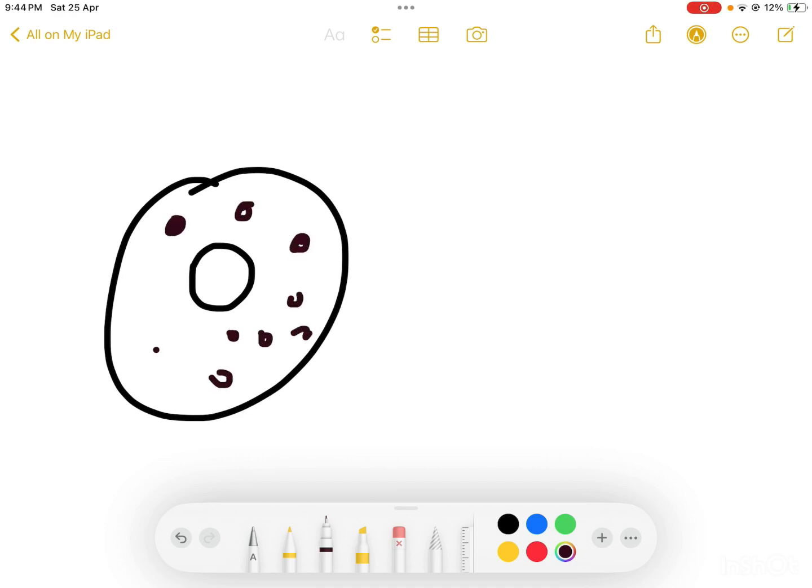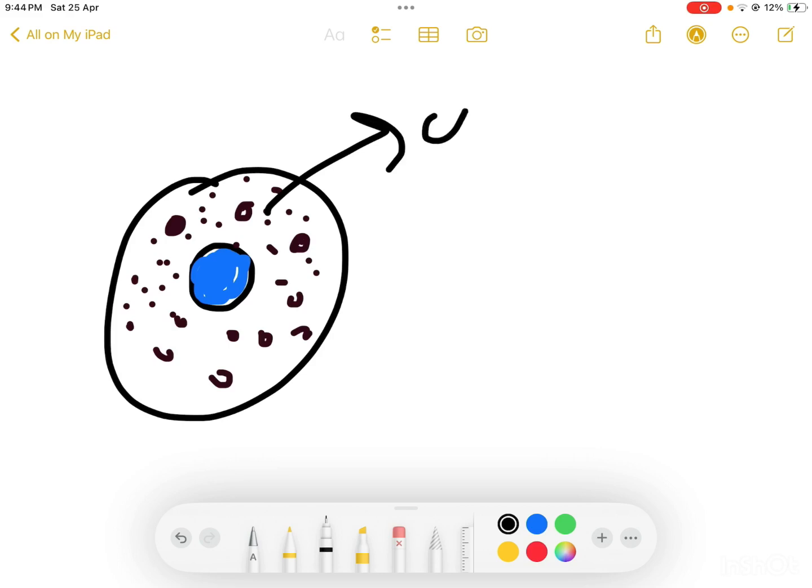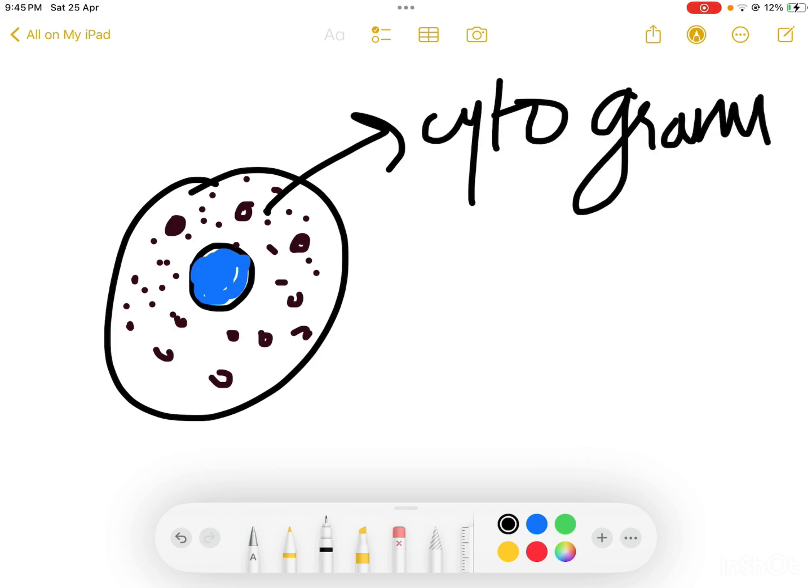You will see granules, granules, granules. There will be so much of granules. It's going to be difficult to draw for me. So anyway, it is for study purpose. So see, this will be the nucleus you will be getting, and then you will have granular positivity in the cytoplasm. So what are the IHC markers that are going to give you cytoplasmic granular positivity?